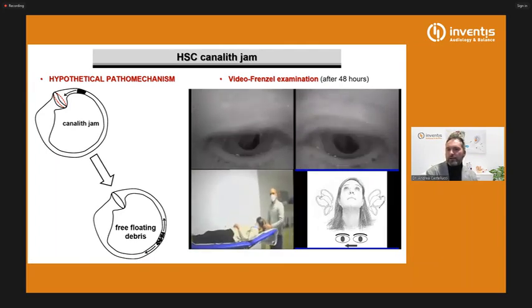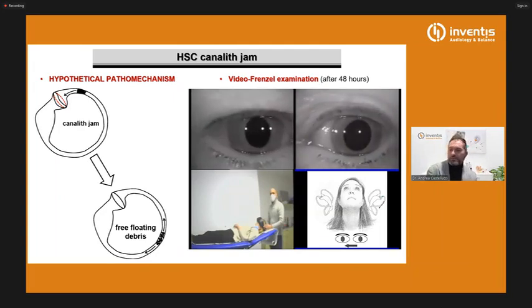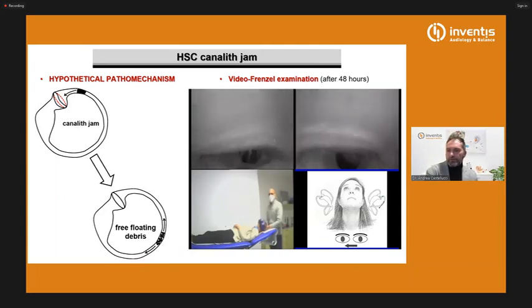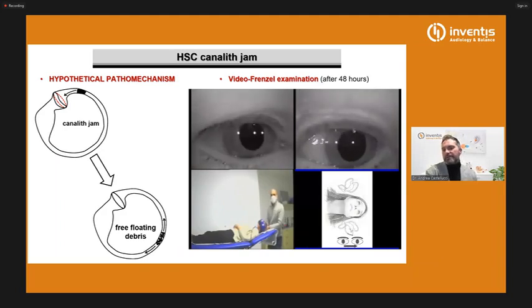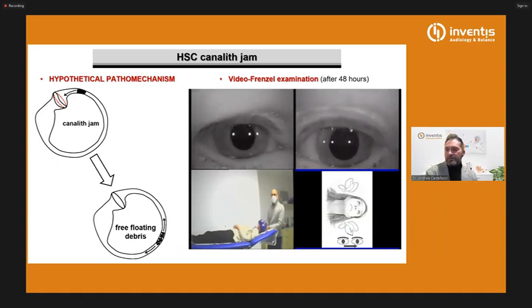Now, at the supine headroll test, we will see the typical geotropic paroxysmal nystagmus on both sides. Now, at the supine test, there's a right beating nystagmus. Now, on the left side, after a while, there is a huge conversion of nystagmus, paroxysmal conversion of nystagmus, because otoconia are going toward the affected cupula on the left side.